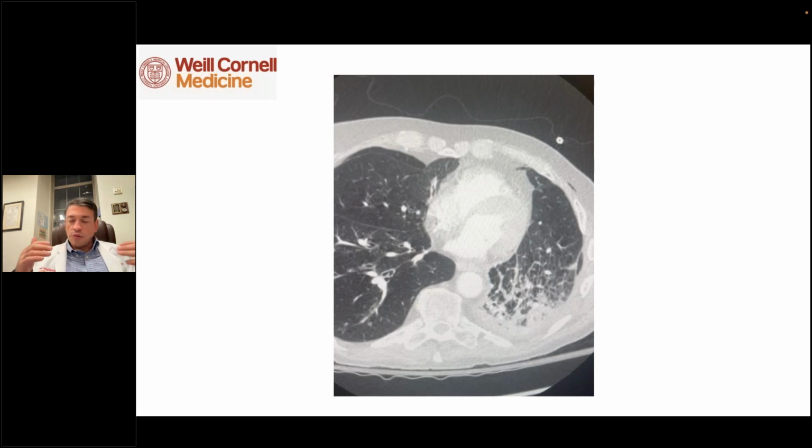Sometimes a question comes up: how do you troubleshoot these situations? Well, if you have lobar atelectasis, the ipsilateral lobe does not fully expand, and you have a leak, then your only option is to remove a valve. So this patient underwent removal of one or two of his valves, which allowed everything to open up, and then we were able to do pleurodesis. So it's a bad problem, and it's something we have to always be cognizant of.